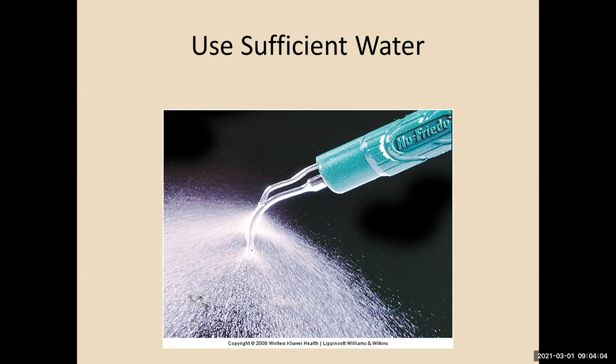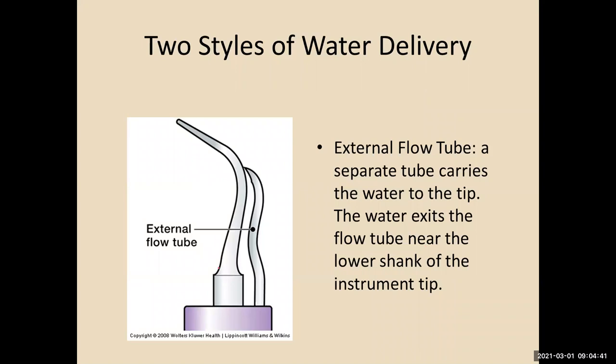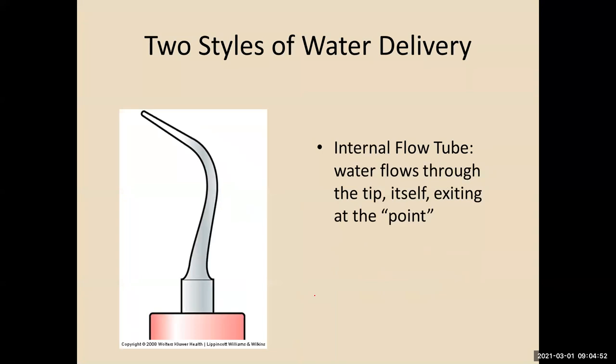You want to have a couple drops coming off, big drops. And then this is what you're looking for, that spray. Now this particular insert has an external water line, which I used to like a lot, because if you were doing, say, the mandibular anterior or maxillary anterior linguals, you could move this off kilter just a little bit. And what you'd do is you'd get your water going into the pocket, but you wouldn't have the spray. So it just made things a little more usable if you were working by yourself. You have your water coming out of here. But they still make these. You have an internal flow tube.